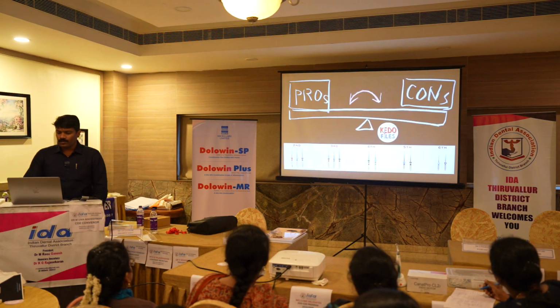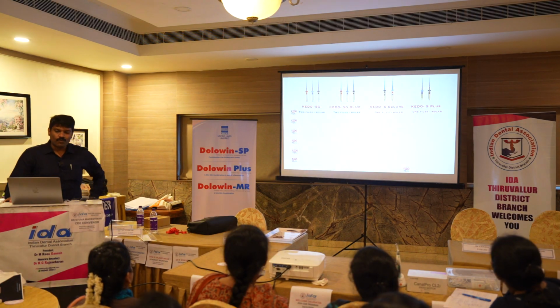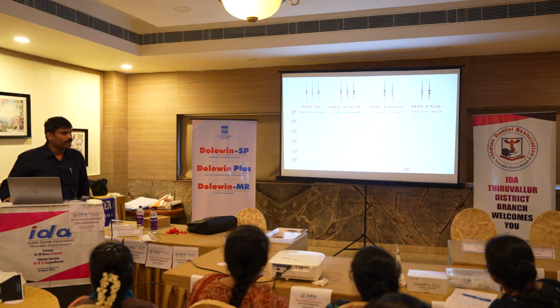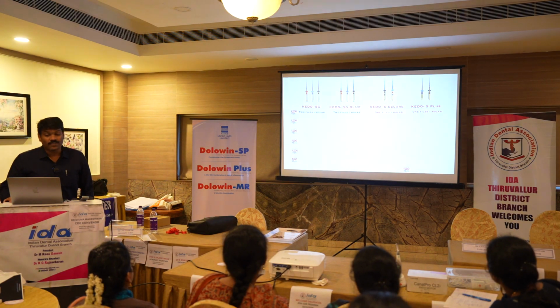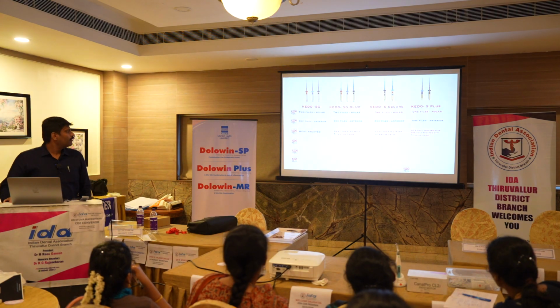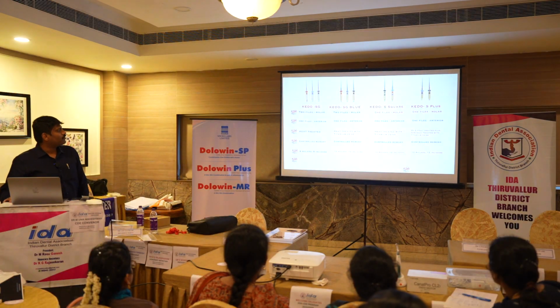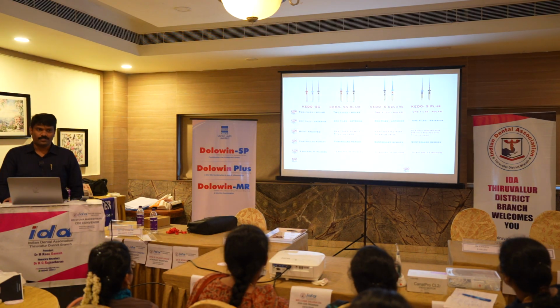So I will give you one good comparison. Just check the red color alone. 2 files for molar, 1 file for molar. That is the advantage of that particular file system. 1 file for anterior in all of them, no advantage at all, the same. Heat treated with titanium oxide, 50% heat treated, 50% not heat treated. Correct? Next, control memory, no change. 8 molars, 8 incisors, 12 incisors, 12 molars.